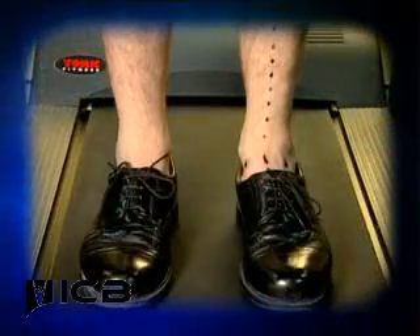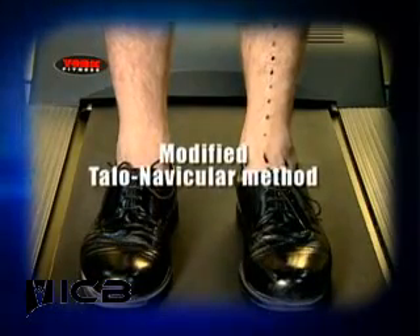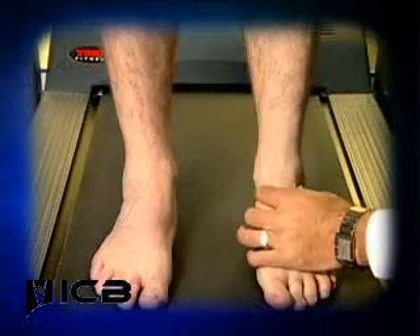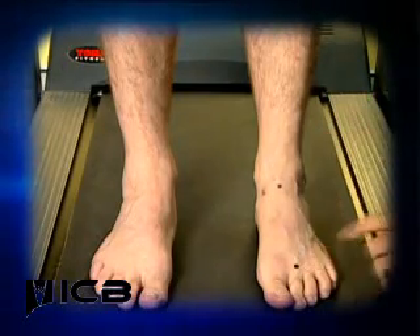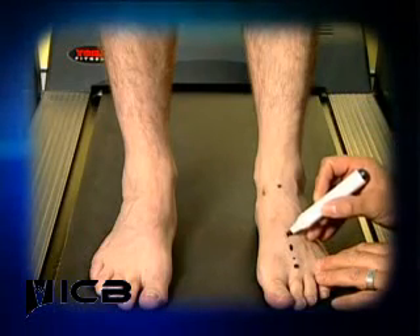To assist in finding this position when the patient is wearing shoes, use the modified talo-navicular method, which marks the anterior lines as such. Firstly, bisect the two dots, then mark out the second metatarsal head position. Then join the bisection and the second metatarsal head.